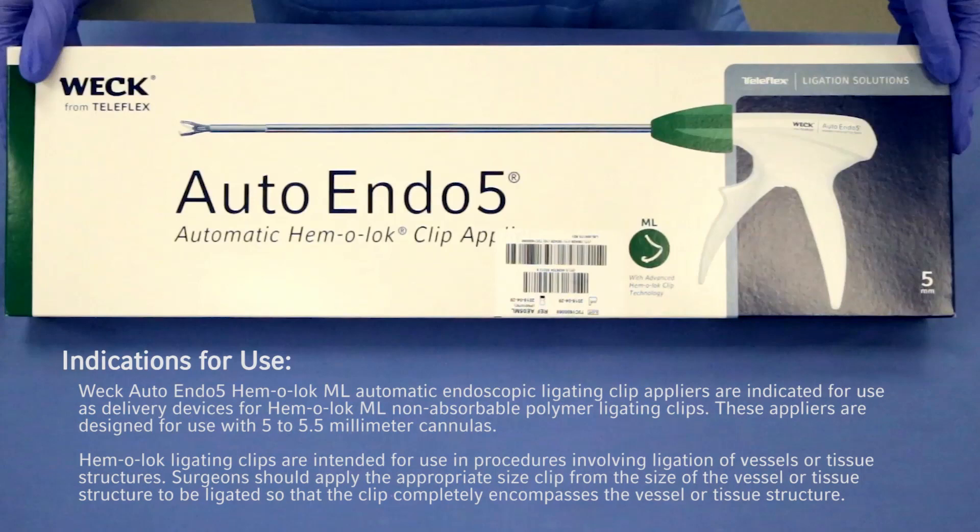Indications for use: Weck Auto Endo 5 Hemolock ML Automatic Endoscopic Ligating Clip Appliers are indicated for use as delivery devices for Hemolock ML non-absorbable polymer ligating clips. These appliers are designed for use with 5 to 5.5 mm cannulas. Hemolock ligating clips are intended for use in procedures involving ligation of vessels or tissue structures. Surgeons should apply the appropriate size clip for the size of the vessel or tissue structure to be ligated so that the clip completely encompasses the vessel or tissue structure.